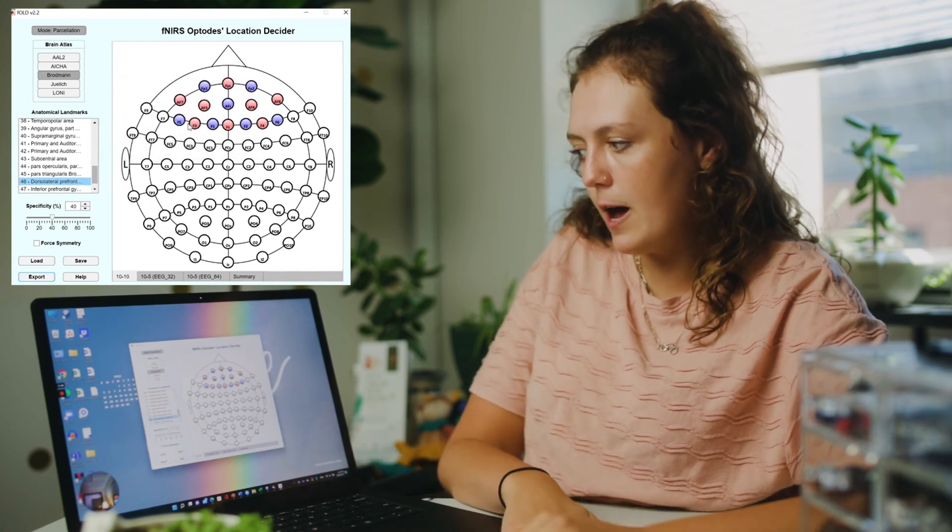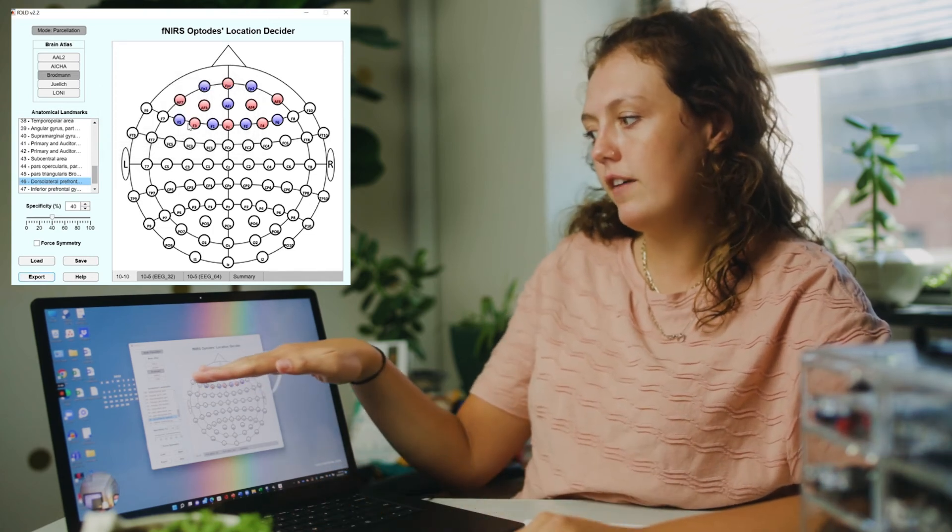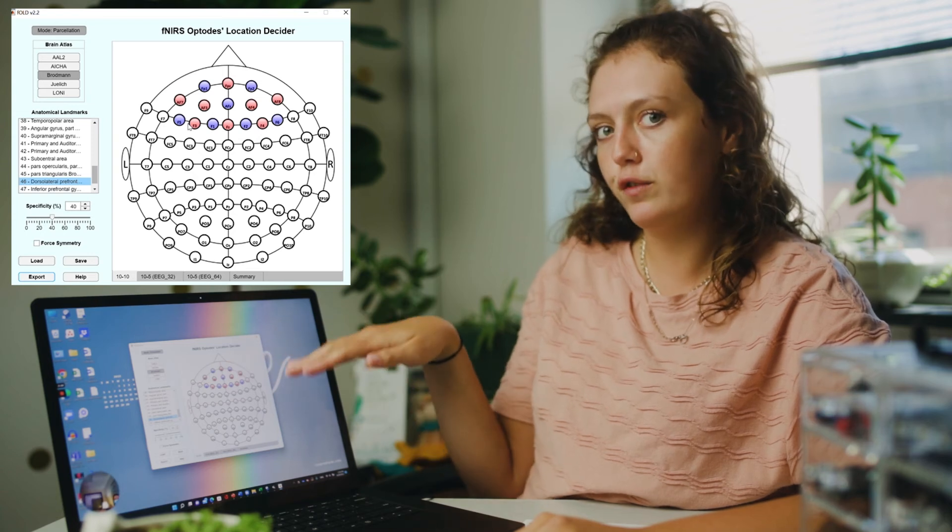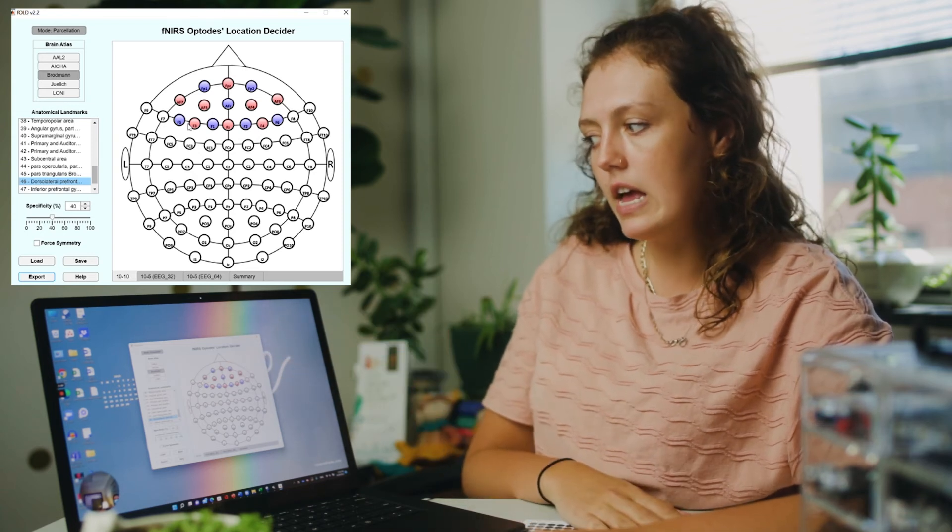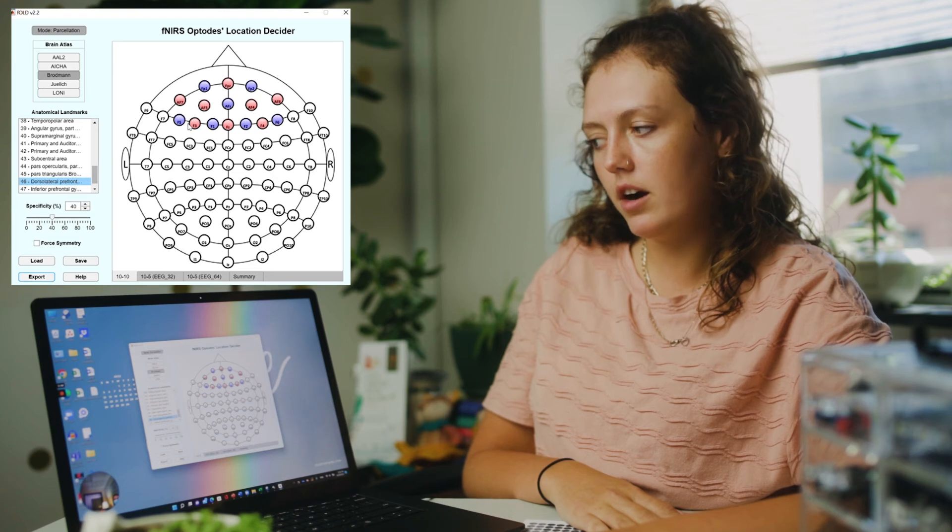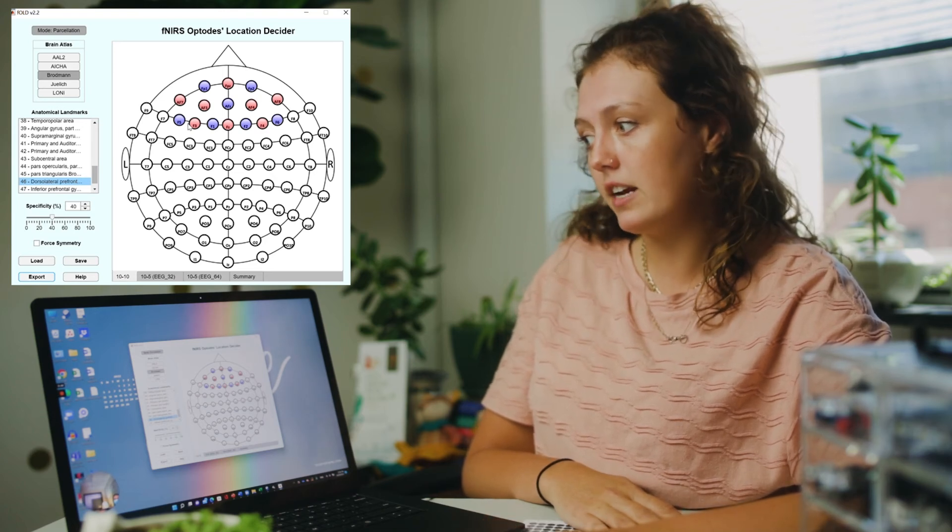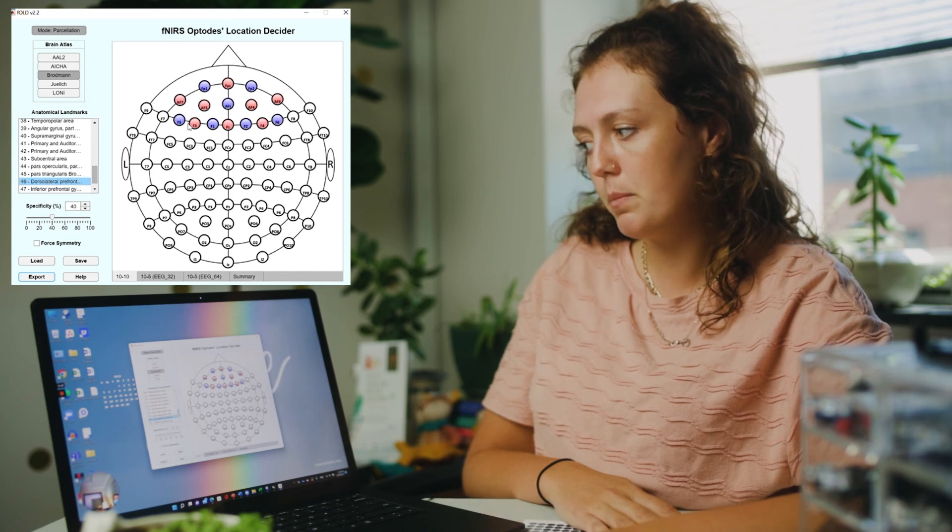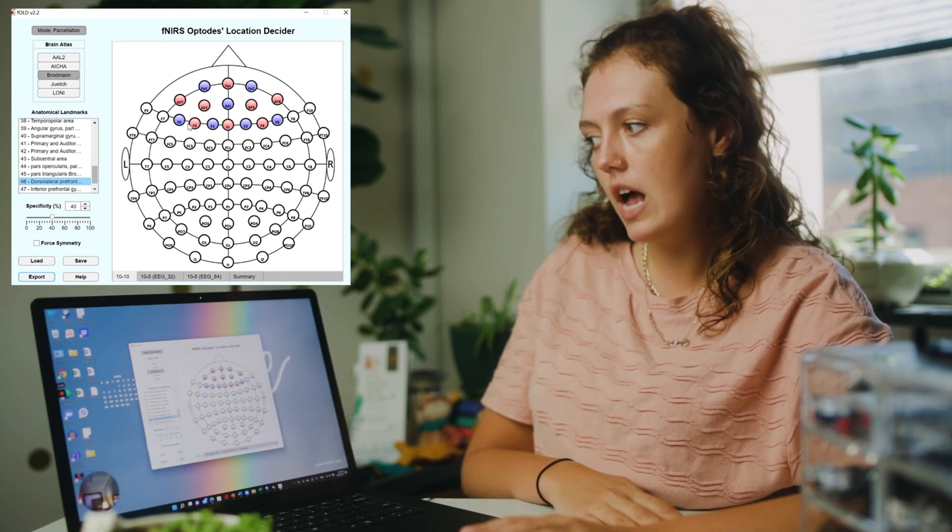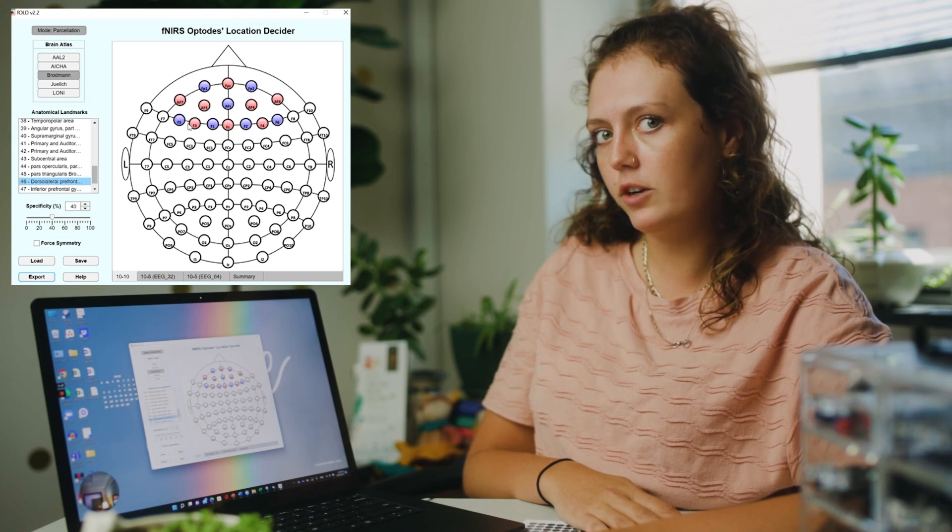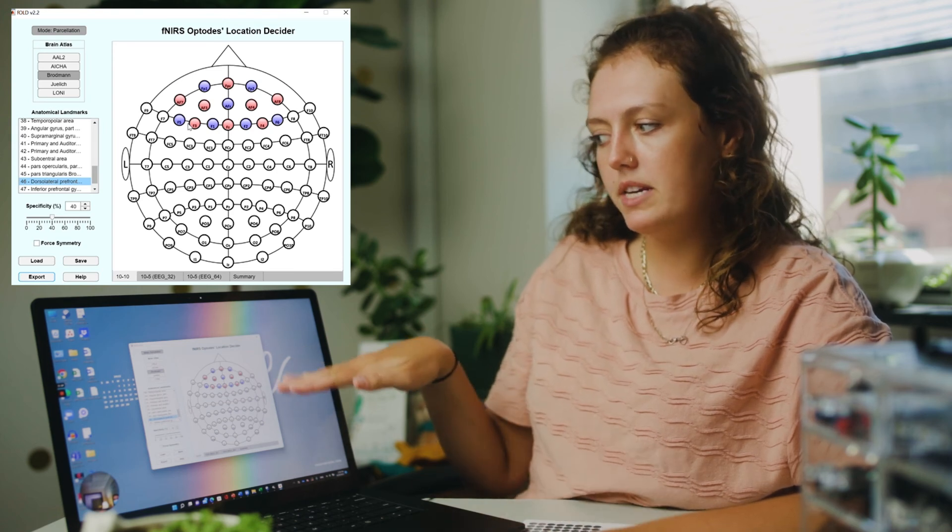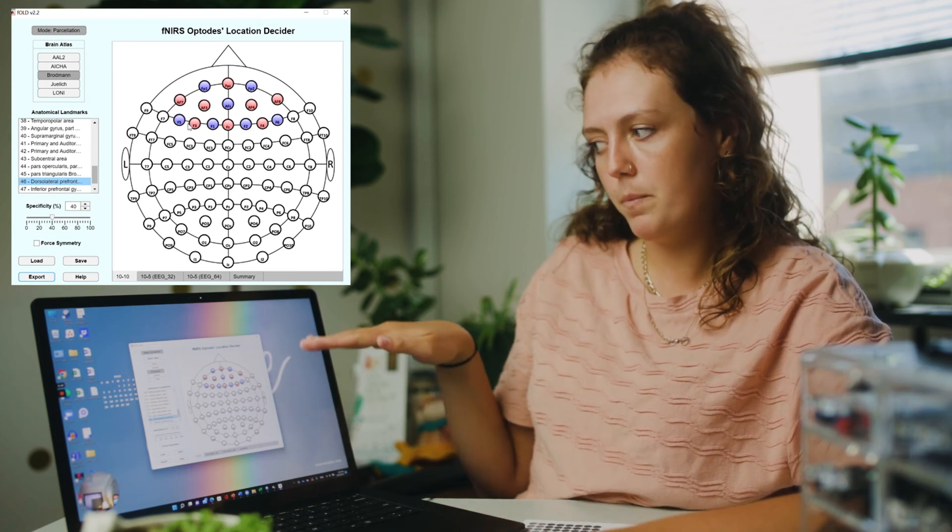And to download the FNIRS Optode Location Decider or FOLD, you can find this on the Nearsite website, which we will link on our website. To preface, the standalone application cannot be downloaded on a Mac. It needs to be downloaded through MATLAB, but any PC can open up this application.